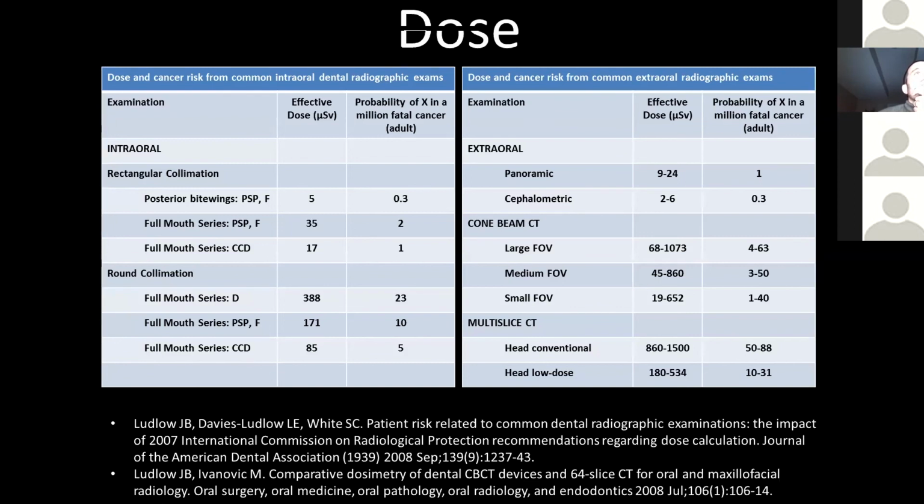So in relation to dose, I'm a hygienist and we do full mouth series and pan for all adult new patients every 3 to 5 years, depending on the caries pathology rate. Would you say this is standard? The base textbook answer to your question is that, except for the ADA caries recall recommendations, there is no standard, there is no routine radiograph from the strictest, most textbook term.